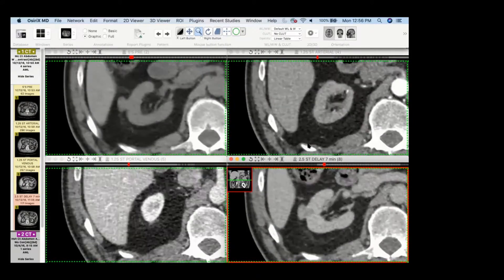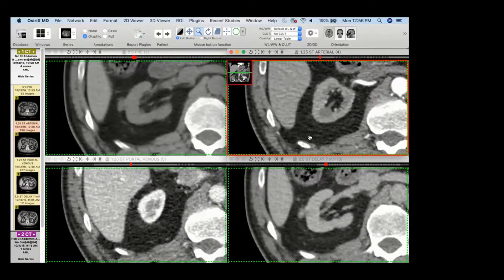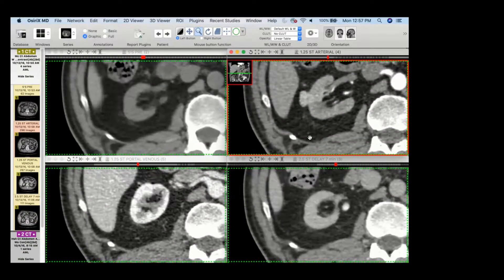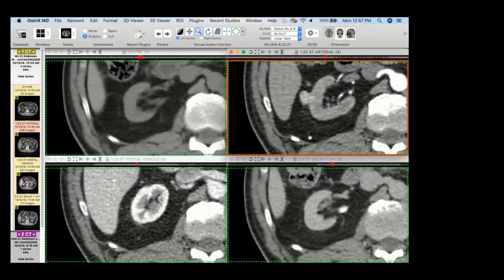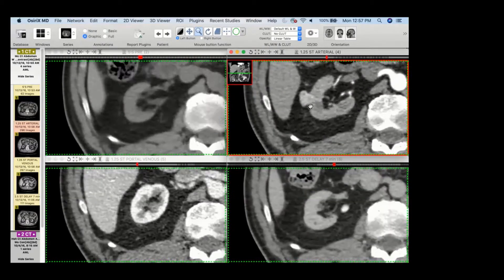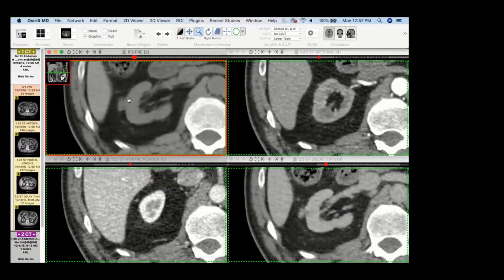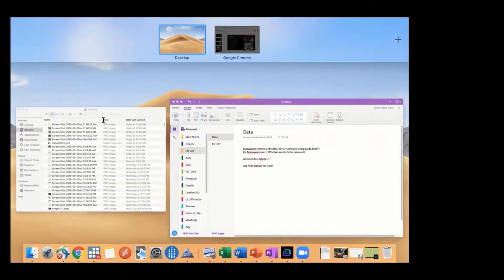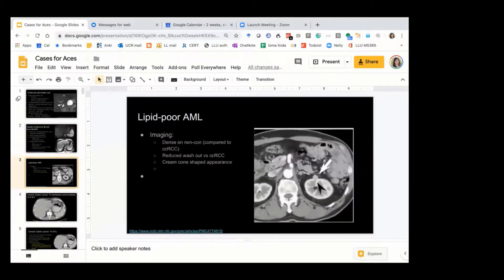Angiomyolipomas can do that. I saw the exact same thing — I was reading the post-resection follow-up, but when I first saw this, I thought it's a lipid-poor AML. And that's what it turned out to be — it was a lipid-poor AML.